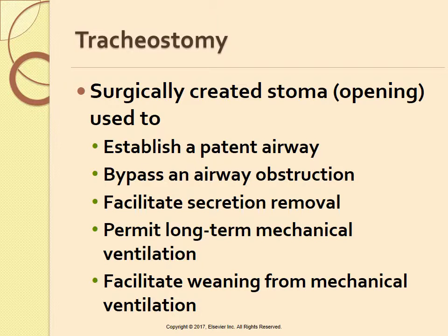Most surgical tracheostomies are performed in the operating room using general anesthesia. These are typically done electively on patients already intubated who require prolonged mechanical ventilation. When swelling, trauma, or upper airway obstruction prevent endotracheal intubation, an emergent surgical tracheostomy may be performed at the bedside.